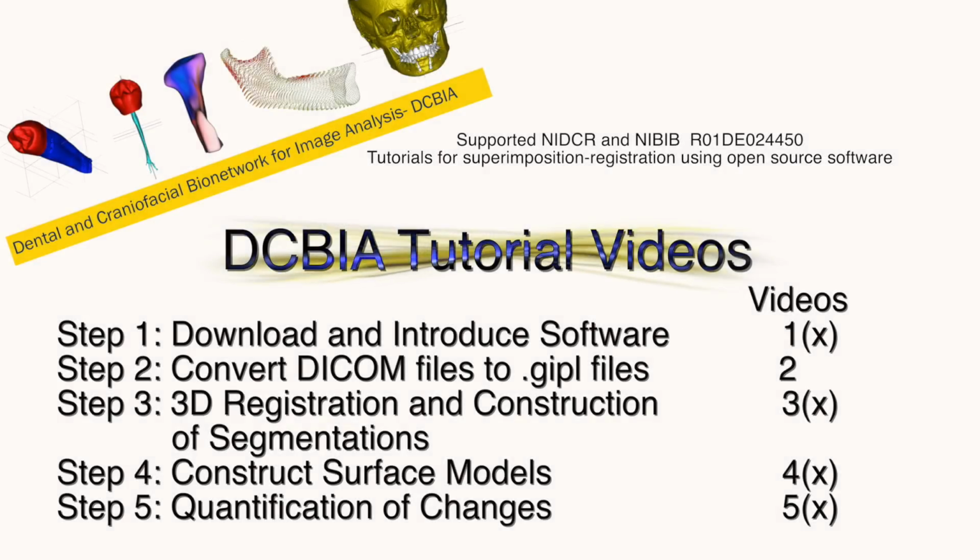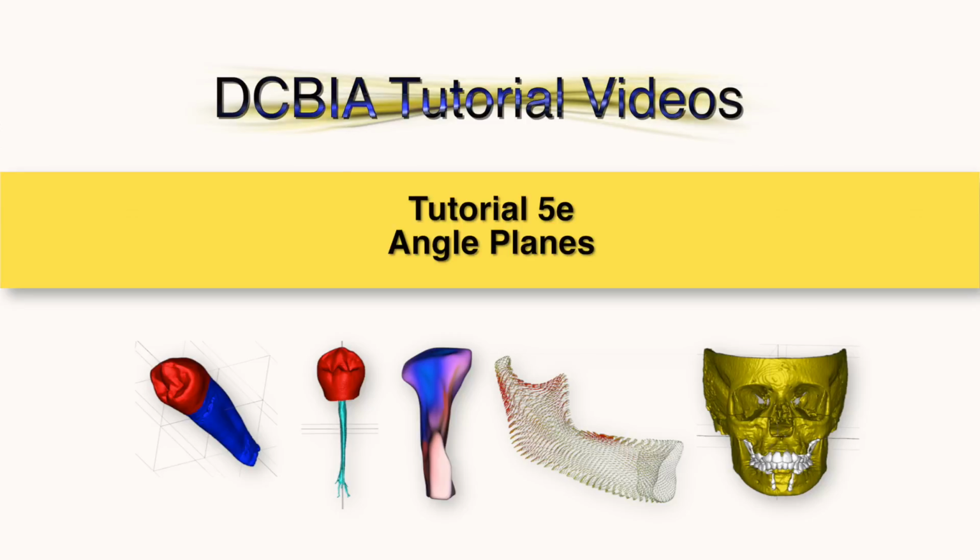This video fits into step 5 of our sequential DCBIA tutorial videos. It's called Tutorial 5E, Angle Planes.